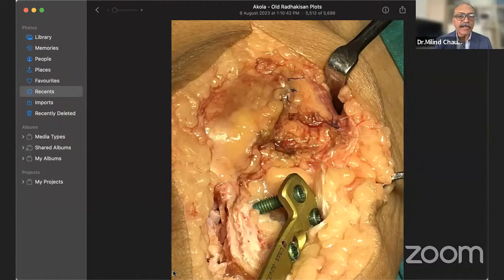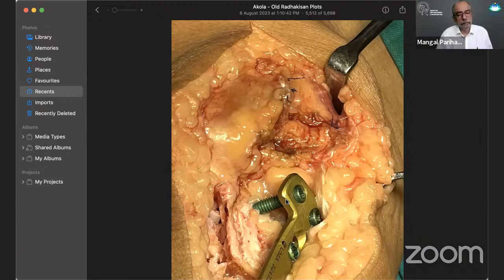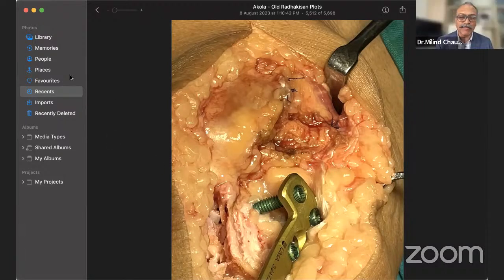So I've taken the liberty of sharing this photograph, and this is the design. To prevent the screws from exiting posteriorly, forget that this is a TCV osteotomy, it's the same story with the MOW, I have to keep the plate jutting out a little proud anteriorly. Yes. That way I solve the problem, but the patient is slightly miserable. They do complain. And so there is an answer to this problem.